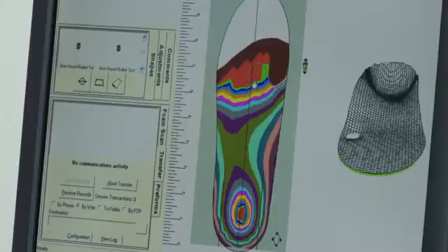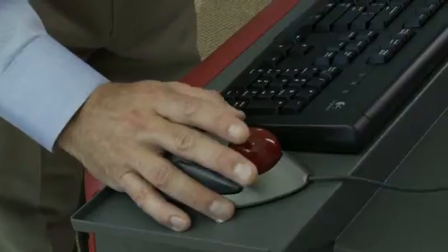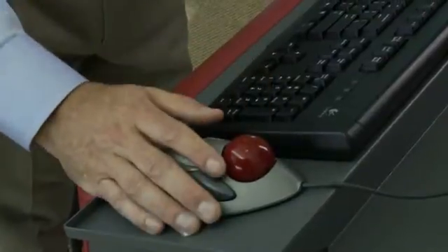Using Amfit's correct and confirm software, you can easily design a number of adjustments, such as heel posting or metatarsal pads. And when you're done, just send that digital record to our full-service lab, where we fabricate and ship your orthotics in as little as one business day.